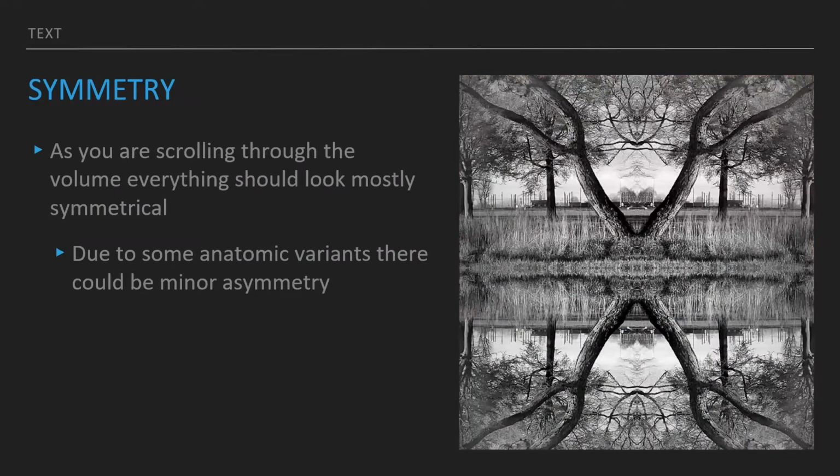Symmetry, this is the biggest thing I try to teach the pre-docs or anybody I ever talk to. As you're scrolling through, you really want to understand your anatomy and the normal variations of these anatomies. There could be some minor differences, but once you understand what normal is as you're scrolling through, you're going to be able to recognize the abnormality that's showing. So it's really important to get that under your belt so that whatever pops out, you're able to see it immediately. Again, some normal anatomy CBCT.